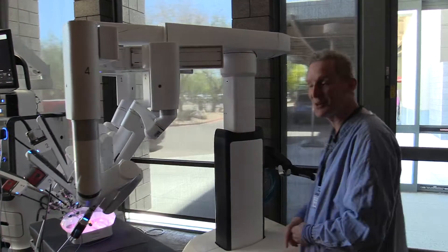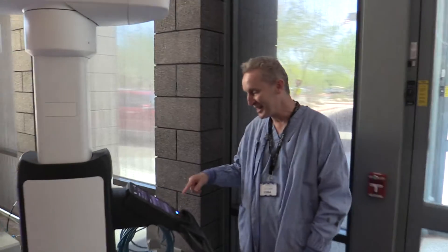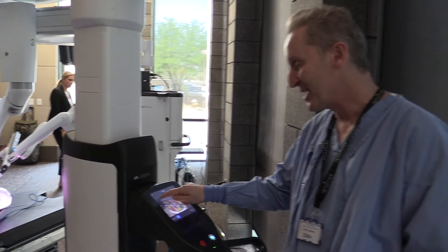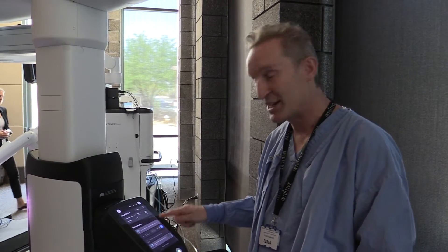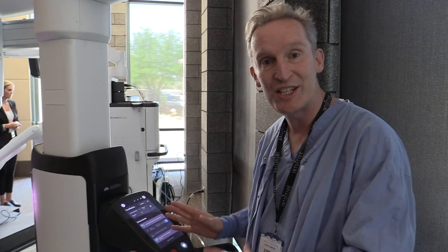If you want to change anything or telestrate, you've got this amazing little screen here. So I can change and I can go and telestrate whatever I like here. It's got its own insufflation on it, so I can change the insufflation, which is pretty cool.